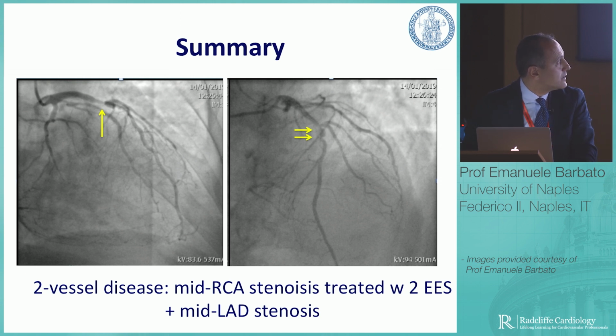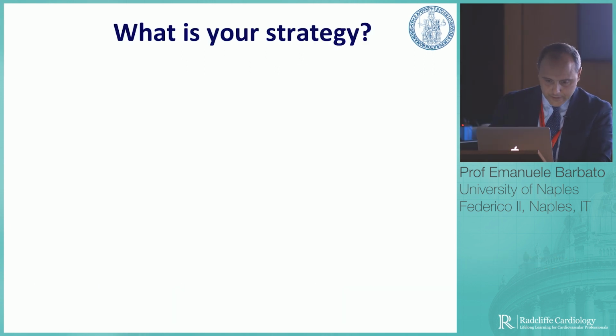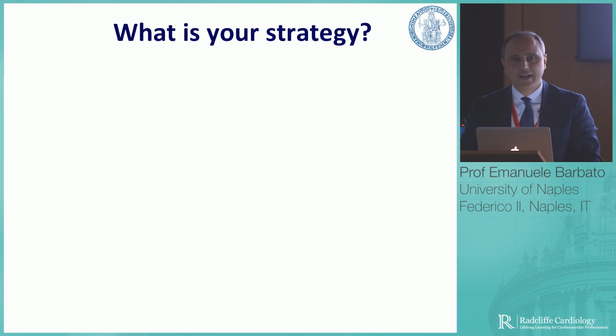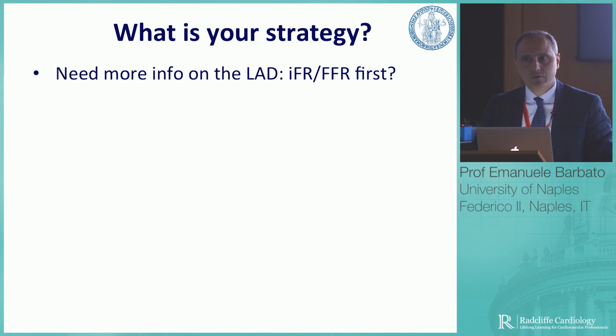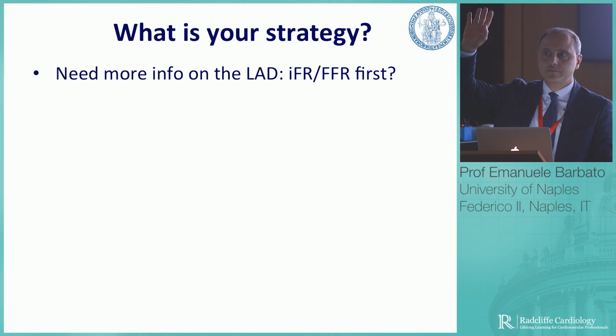We need to treat the left coronary artery, the medial LAD. And before sharing with you my strategy, I'd like to hear your strategy. How would you treat this patient in your practice? Who needs more information in this case and would like to know more about the hemodynamic significance of this LAD lesion? Who wants to do iFR, FFR? Raise your hand.